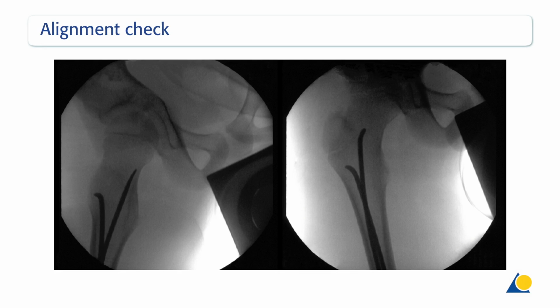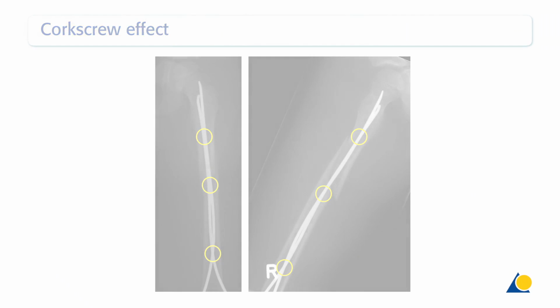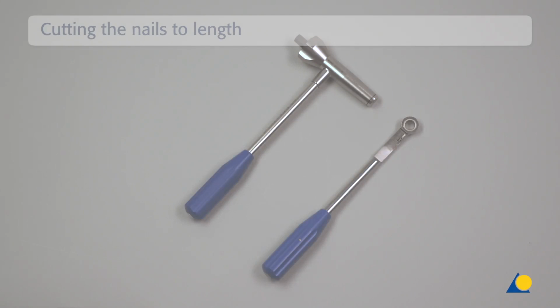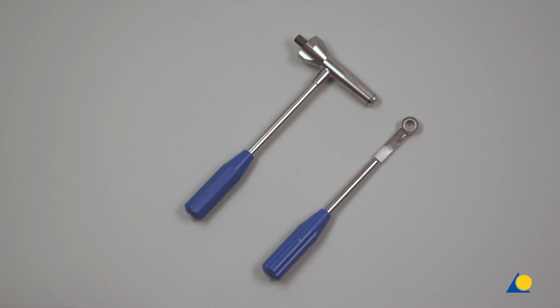Clinically, the final position of the nail's tips is controlled using the image intensifier in AP and axial lateral views. The corkscrew effect, where the nails twist around each other, must be avoided. Once the nail tips in the proximal fragment are correctly located and verified under image intensification, the nails can be shortened to the required length with the cutter for 10, which allows the nails to be cut very close to the bone cortex.